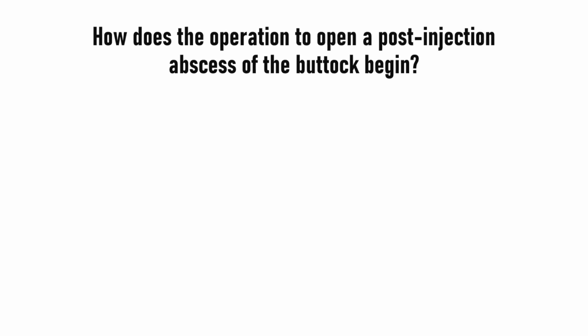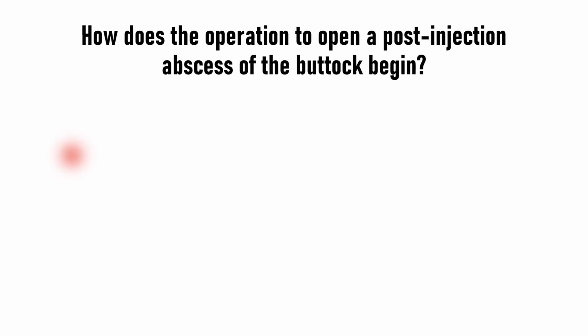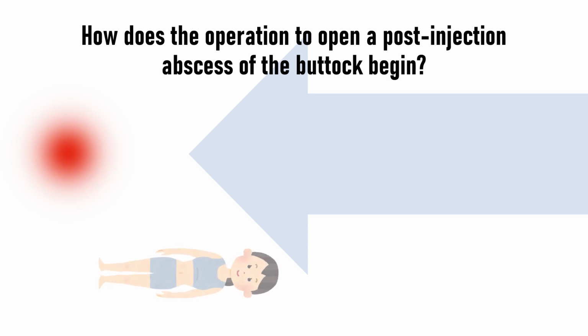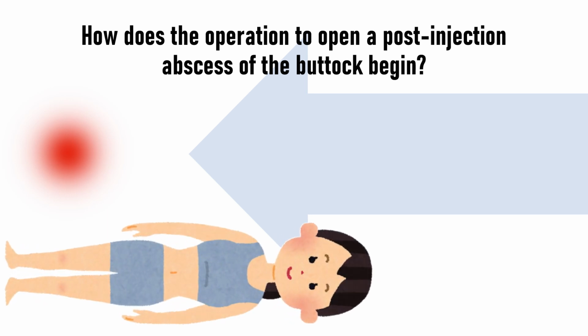The patient is placed on the healthy side. The perineal and genital areas are protected from the flow of pus with a linen or towel. The surgical field is treated with iodinate before performing anesthesia. It is necessary to mark the line of the proposed incision with a cotton brush moistened with brilliant green.